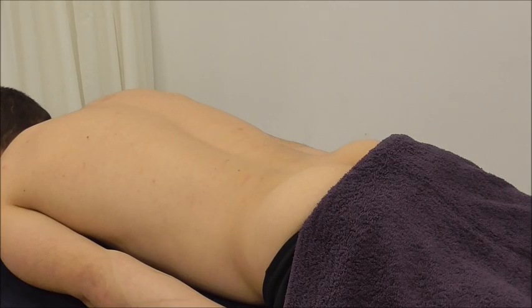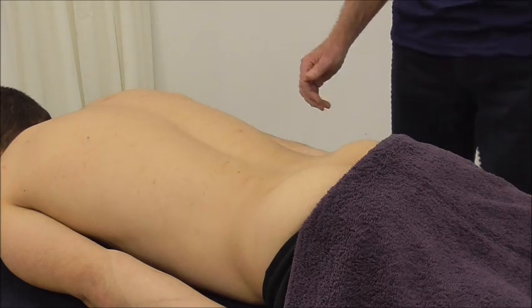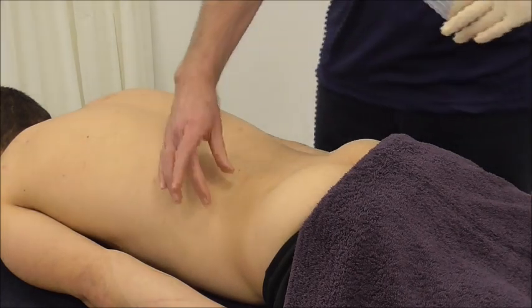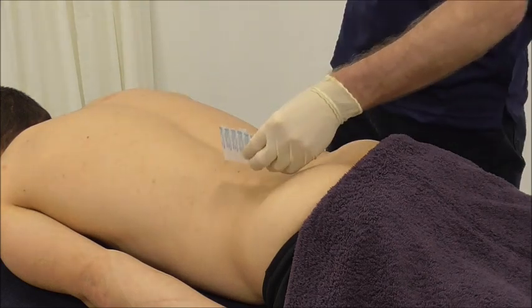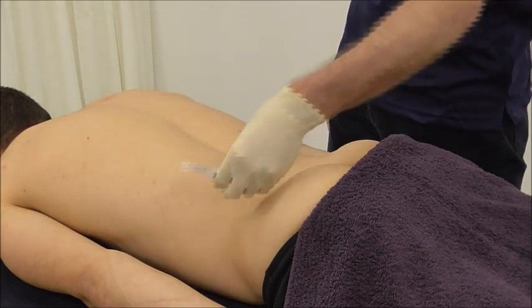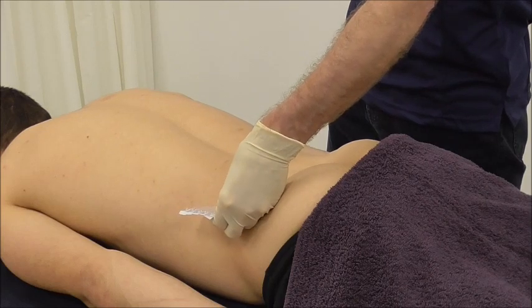If I want to needle the iliocostalis, the technique is broadly similar, but because I'm further out the muscle is thinner, so my angle rather than being 45 degrees would be about 20 degrees to the skin.